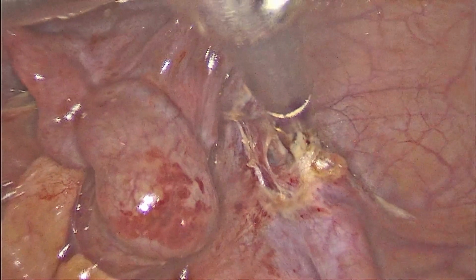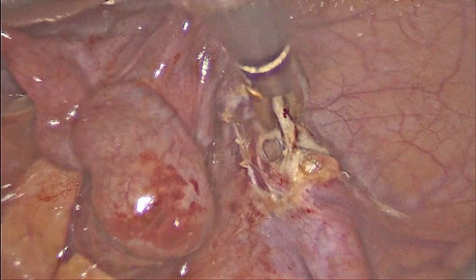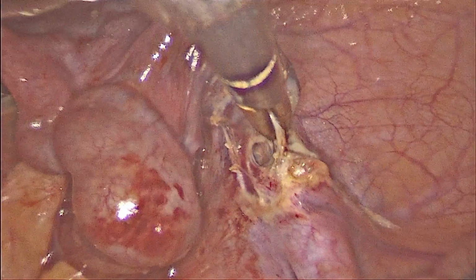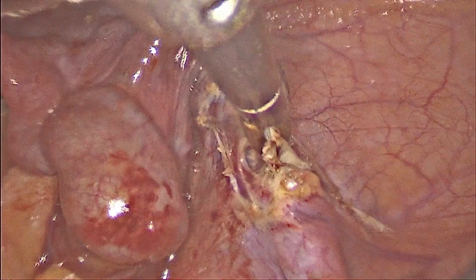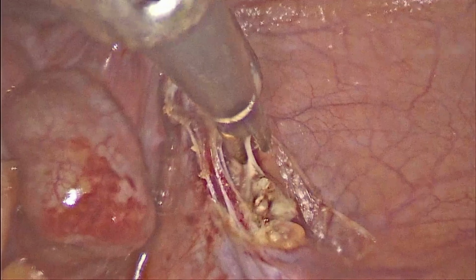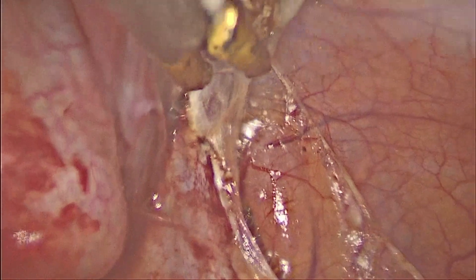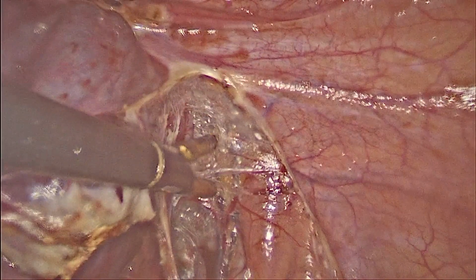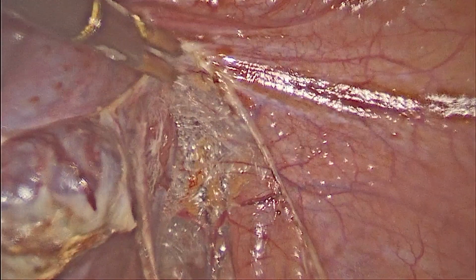So since she was opting for total hysterectomy, we thought we would start with the division of the infundibulopelvic ligament, then we will get exposure to the other pedicles. We can see that once it is divided, the pedicle got retracted. So now we are continuing the dissection towards the ovarian ligament.